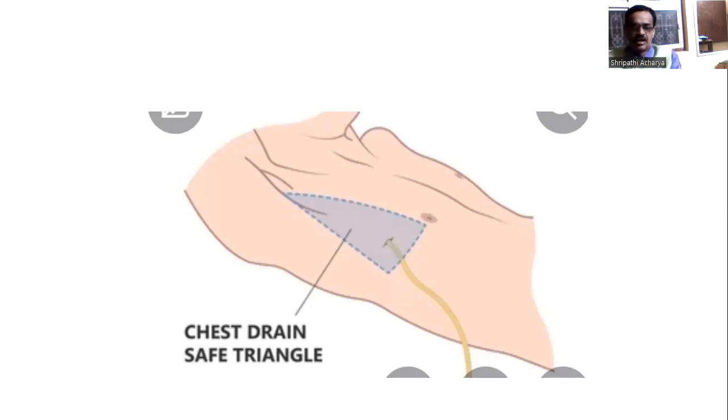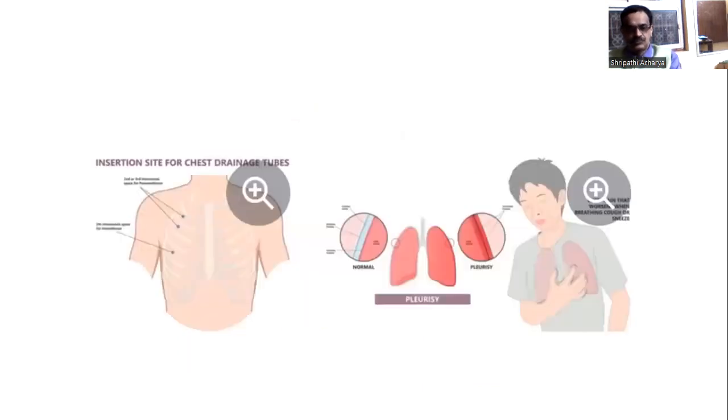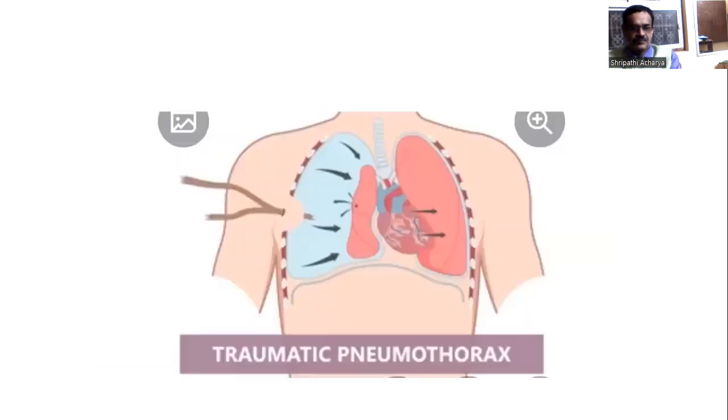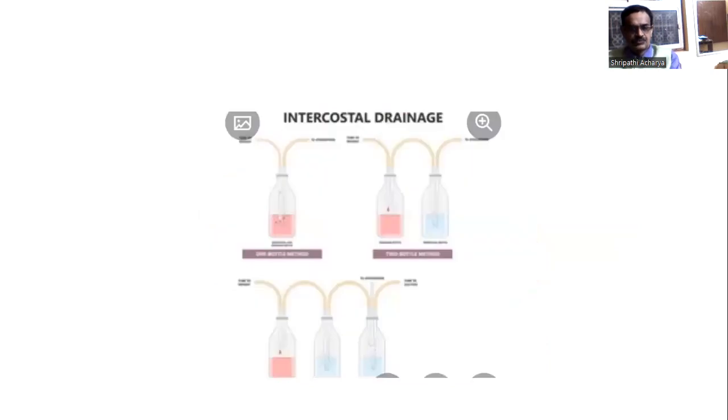You are not harming or injuring the lung. See, position, tapping, lung cancer, traumatic pneumothorax. Fluid is collected.